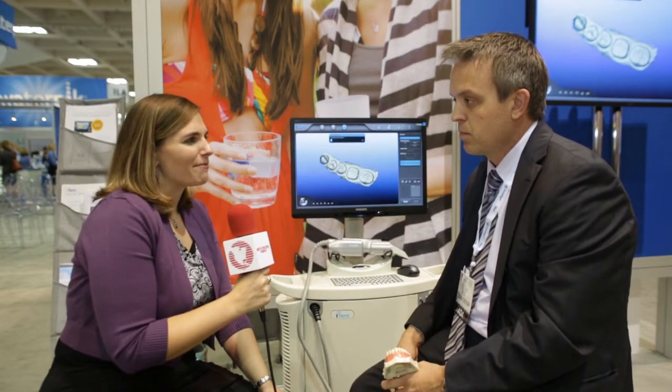What advice would you give to dentists considering an intraoral scanner in their practice? First and foremost, I would definitely pick a system that does not have any powder coating of the teeth. We want to scan the actual teeth themselves and not a reflective agent on the teeth. I also would recommend talking to your laboratories, because the laboratories work with these models every day. The laboratories I've talked with love these models — they're very durable and extremely accurate. So they keep the dentist and the lab happy. No remakes makes everybody happy.